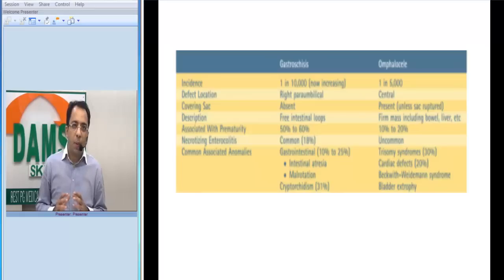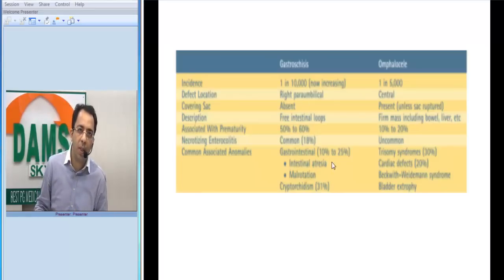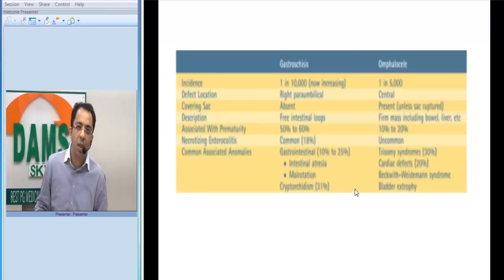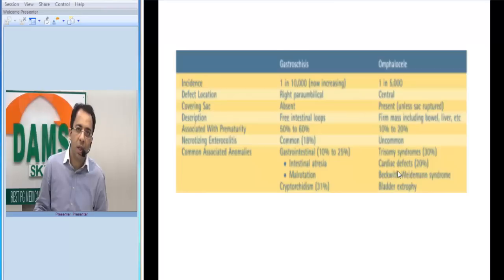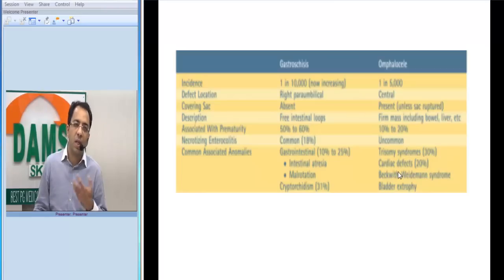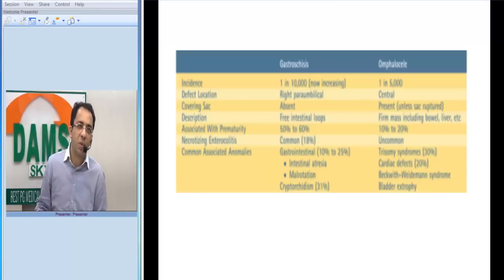Because in gastroschisis the bowel loops are free-floating in the amniotic fluid, more complications are gastrointestinal. Omphalocele, on the other hand, is more associated with chromosomal abnormalities — trisomy 18 being the characteristic one — as well as cardiac defects and bladder exstrophy. So chromosomal abnormalities are more common in omphalocele.